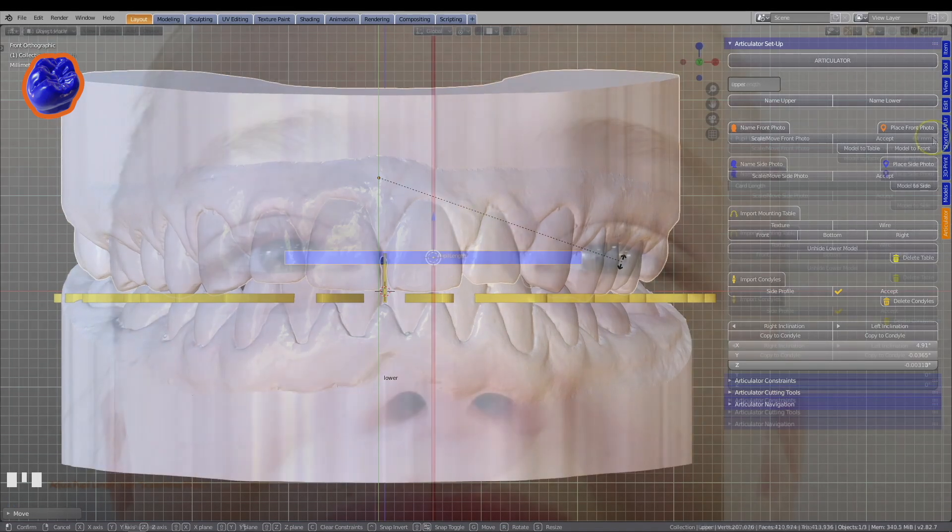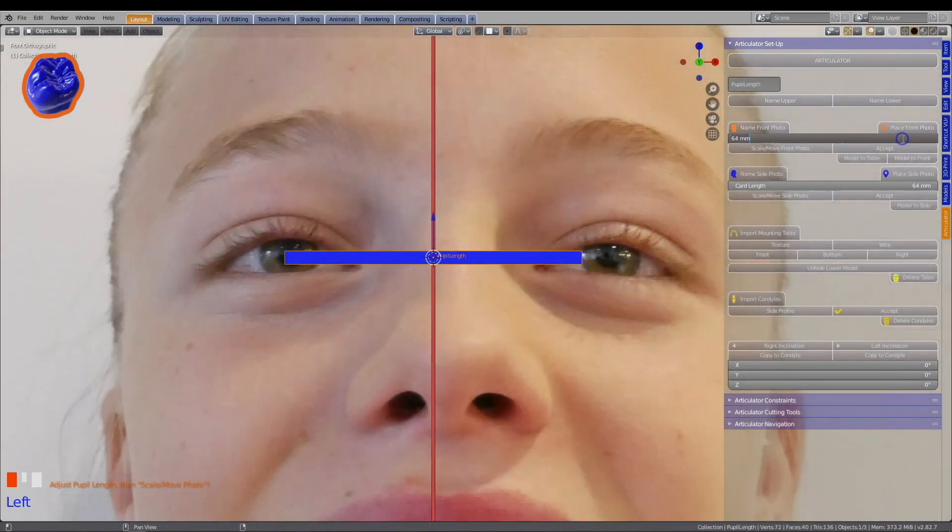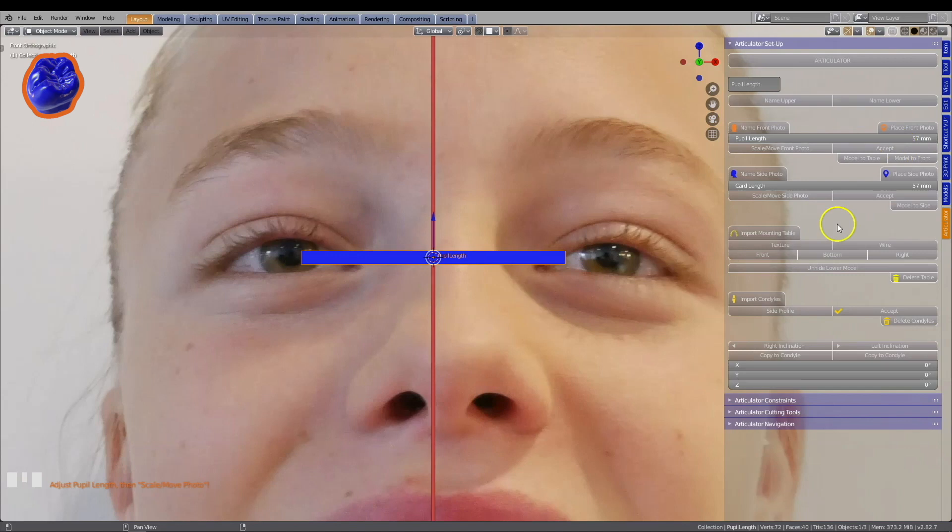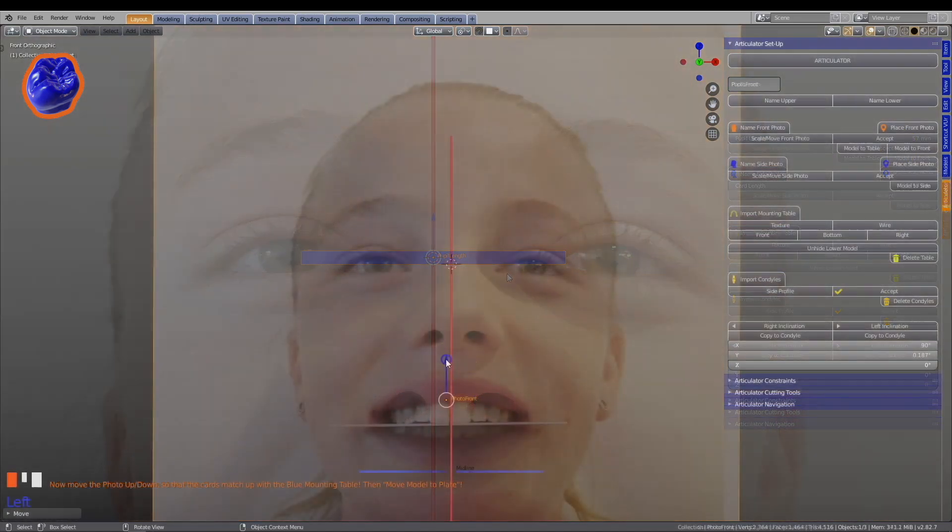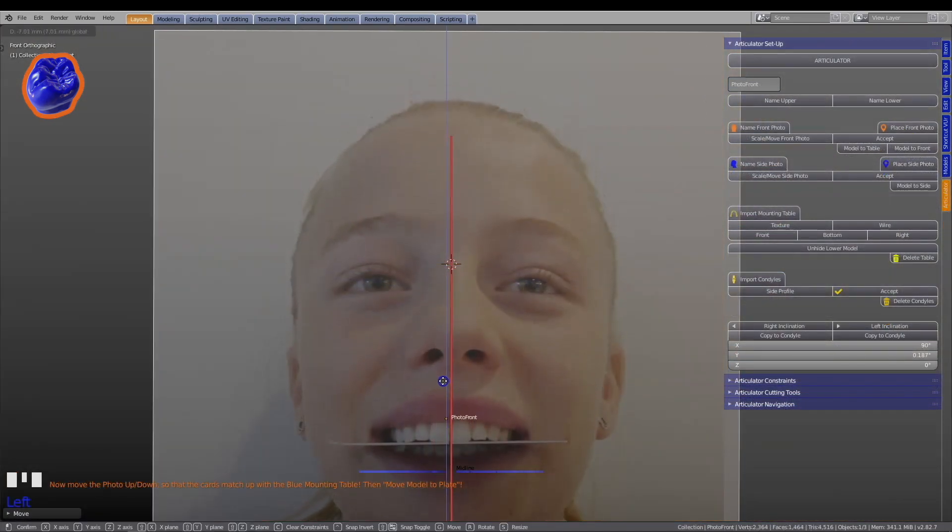Then explore our latest innovation with Blender for Dental's articulator and virtual facebow module.